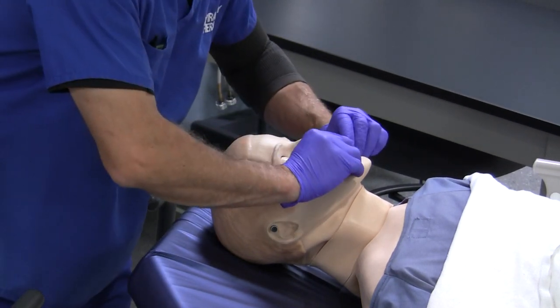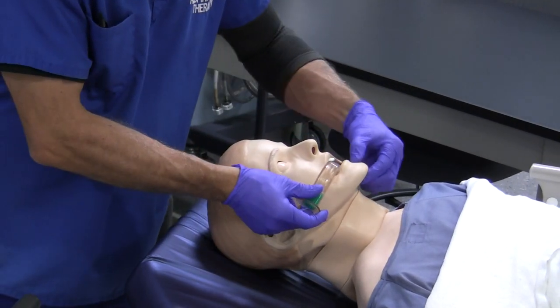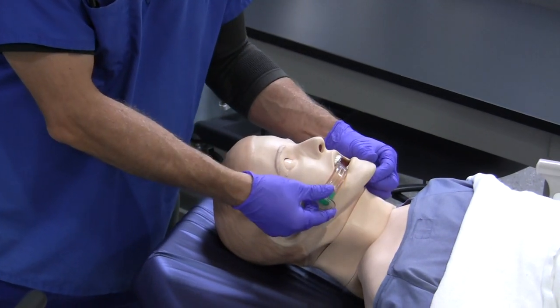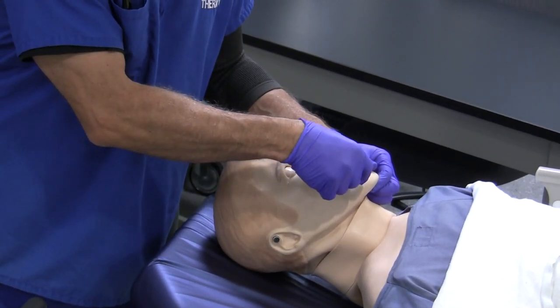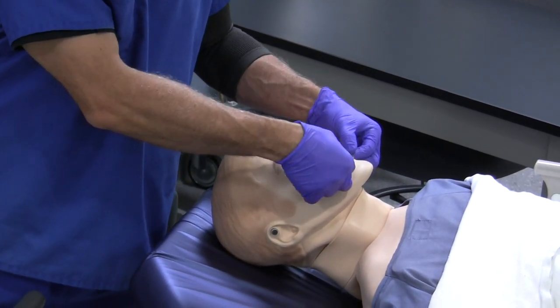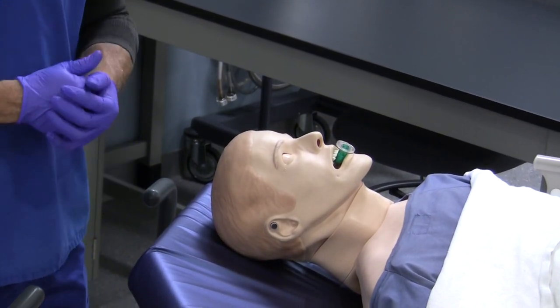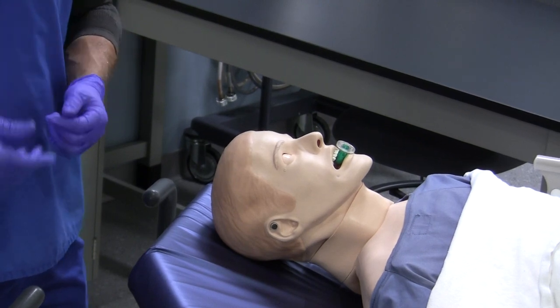Another way to insert the airway is to start at the corner of the mouth, insert the OPA laterally, advance it roughly half the distance, then transition it to the forward position and continue to advance it until the flange rests against the patient's lips or teeth.